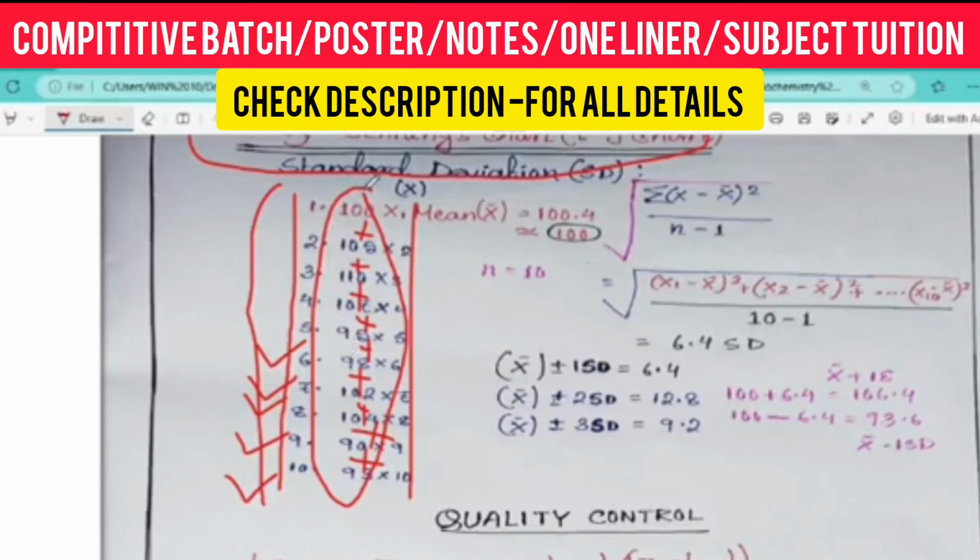So just focus here properly, one by one. If you are missing these things, you will not be able to understand. So 10, right? Firstly I have to sum up the whole value and divide by 10, and we are getting 100.4. That is our mean. 100.4 is near about 100, so our mean is 100.